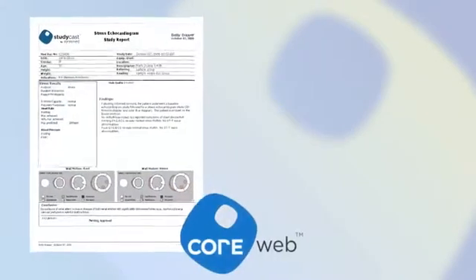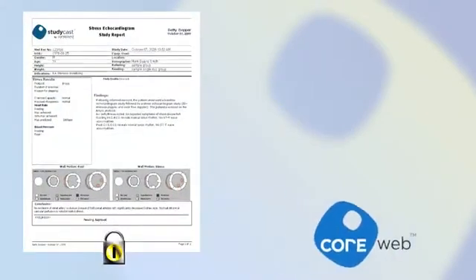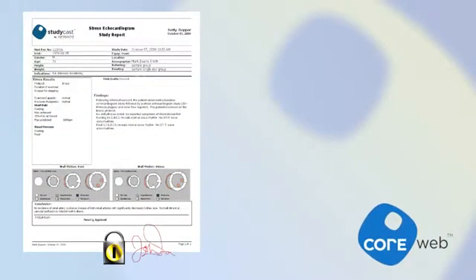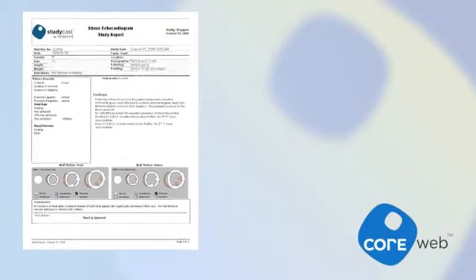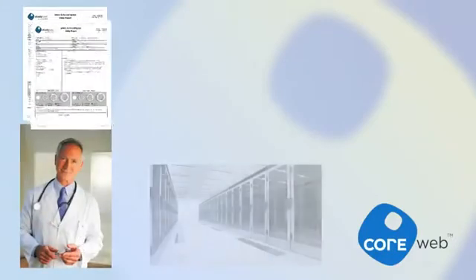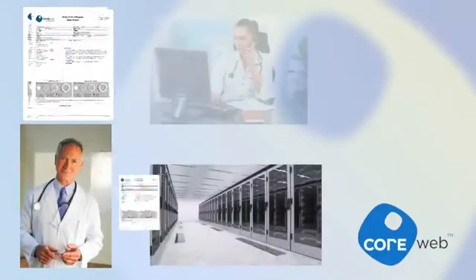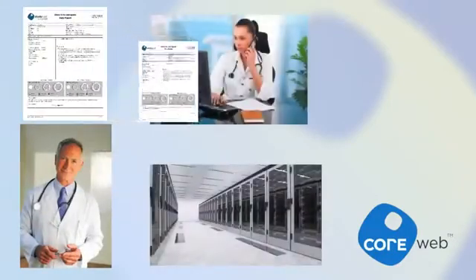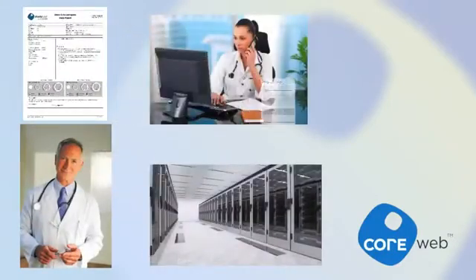CoreWeb generates a final report in the form of a secure, digitally signed PDF and delivers it anywhere you specify. These final reports can be sent to the referring physician, an EMR, or any other desired recipient.